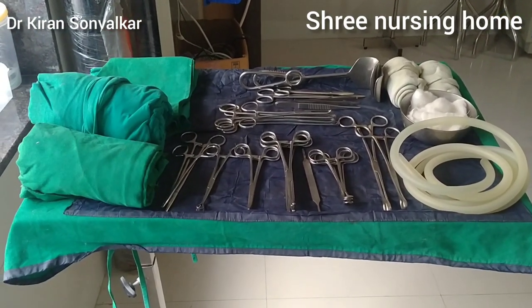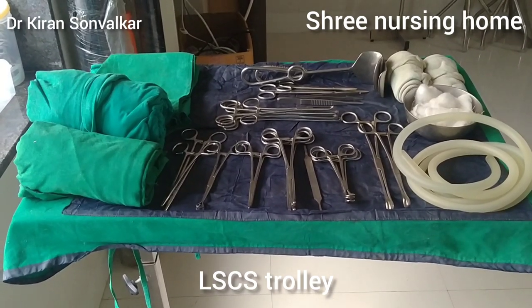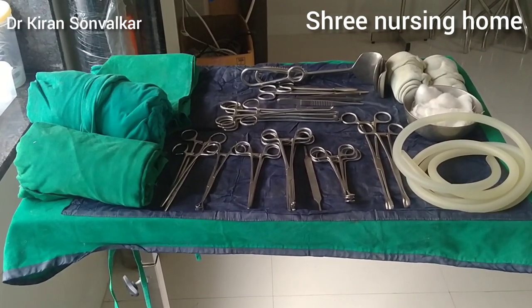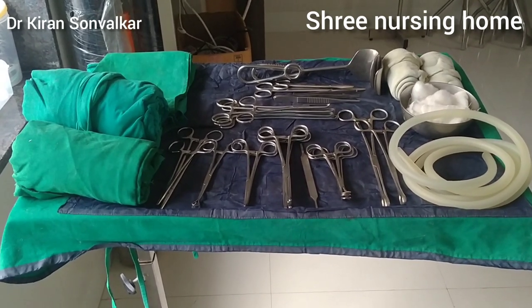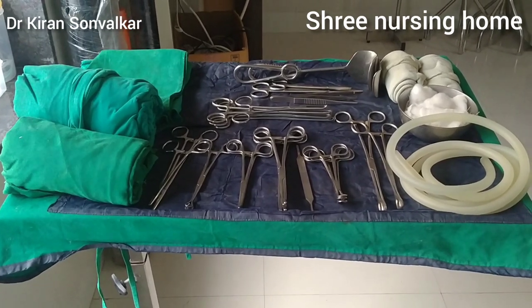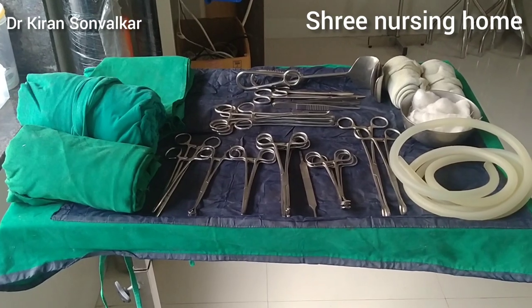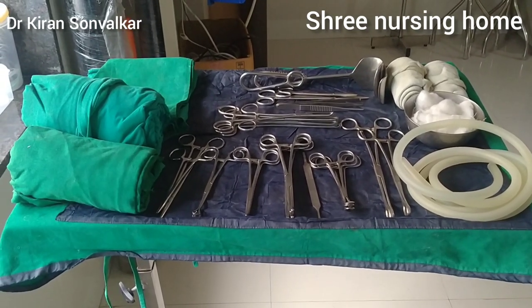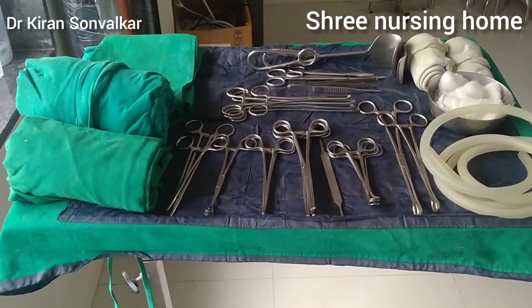Kiran Sonwalkar. Today I am going to talk regarding lower segment caesarean section trolley or LSCS trolley. In common language you call it a caesarean trolley. These are the minimum requirements for caesarean section. You can take maximum as per requirement of the case and as per requirement of the surgeon. So let's see what it contains.